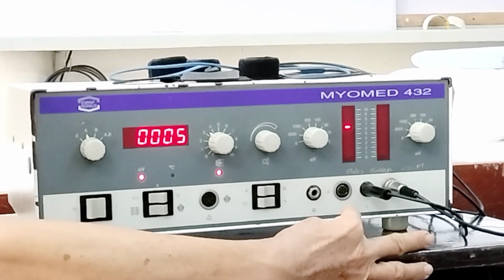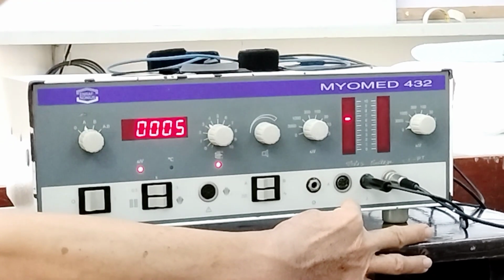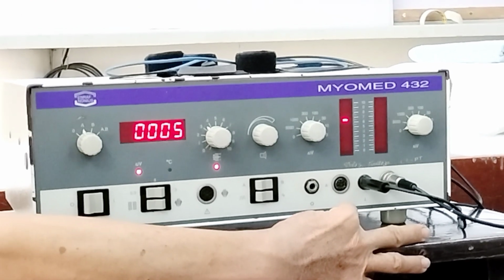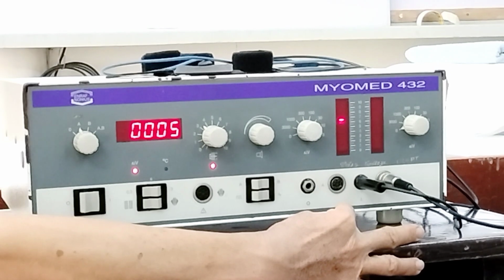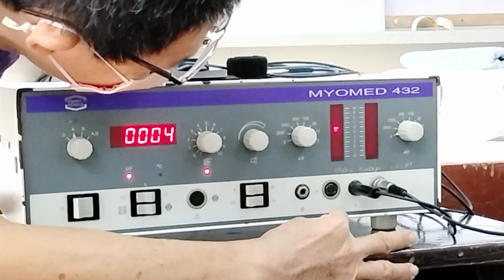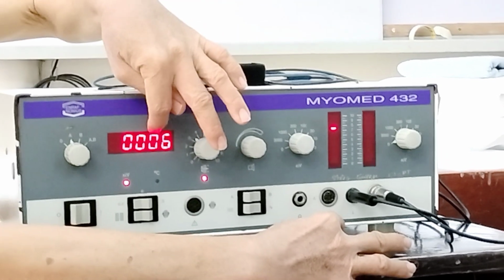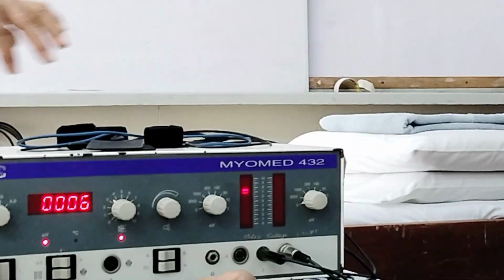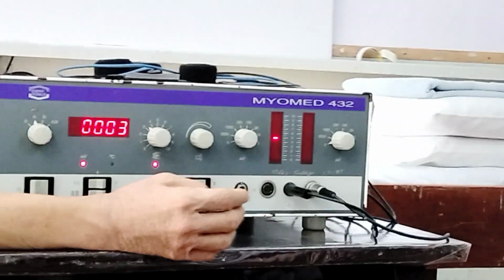So it will change, supposedly this is 6, or 7, whatever, going higher. So it will correspond to whatever the value is here. So it is a percentage, in fact.